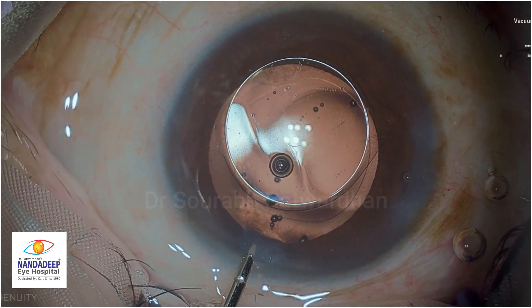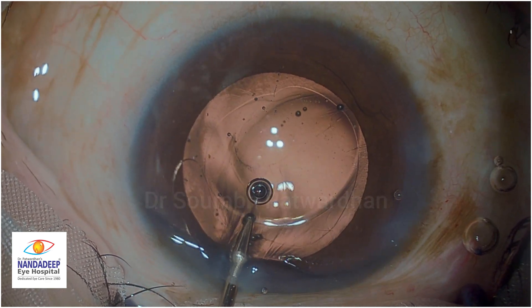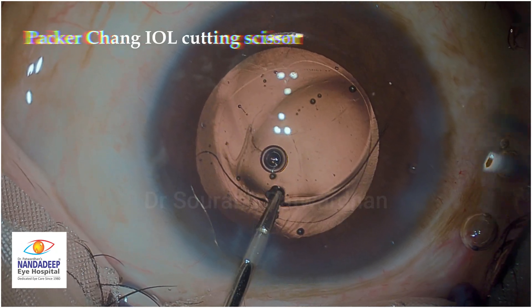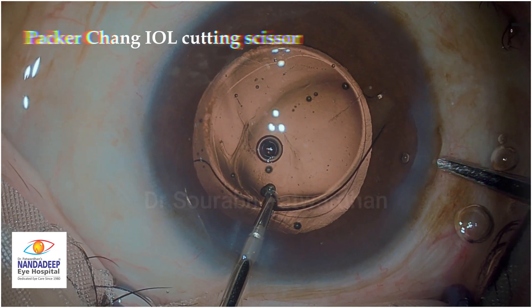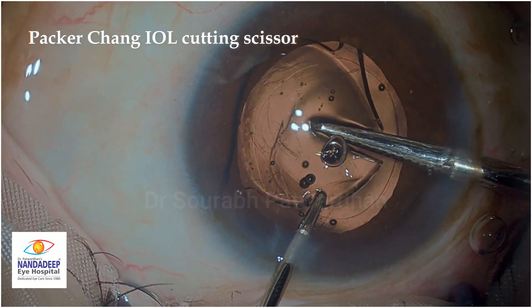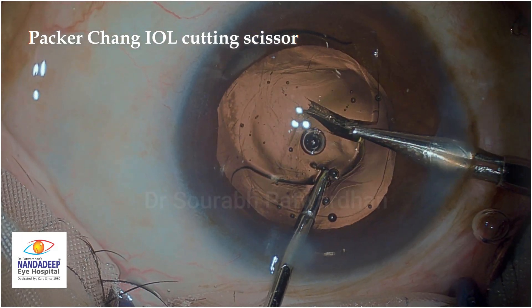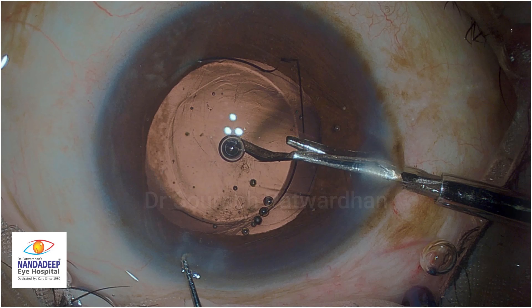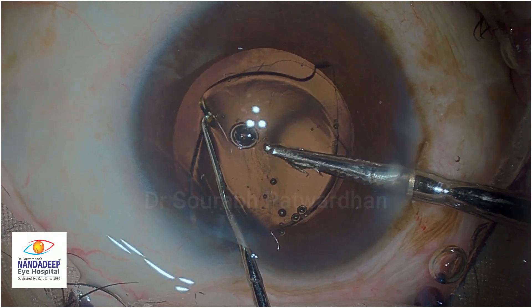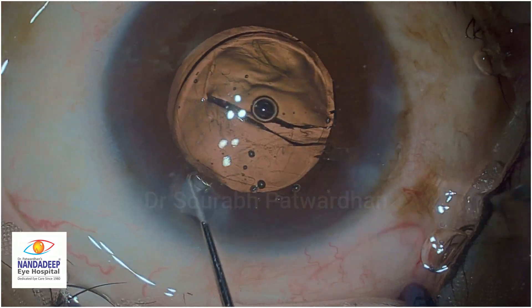What I am going to do here is take out this IOL from the anterior chamber. I have already placed it in the anterior chamber. I use heavy dispersive agent Hylucote on both the anterior and posterior side of the IOL to protect the posterior capsule as well as the endothelium. Now I am trying to use forceps to hold this IOL, but the patient has very prominent eyebrows and that's why I am not getting a good hold. Now I am going to use the Packer Chang IOL cutting scissors - these are cross-action scissors. I am not able to hold the IOL properly because the handle is getting obstructed by the prominent eyebrows. So I shifted to Sinski to provide counter traction, and the goal is to cut around 70% of the IOL right at the middle - I don't want to cut it all the way through, and that's not needed as you will see.